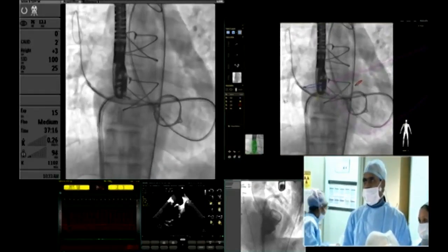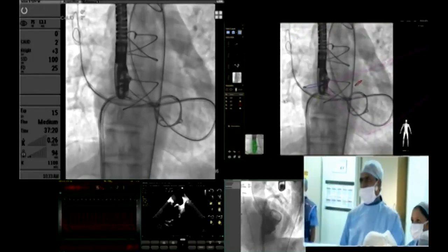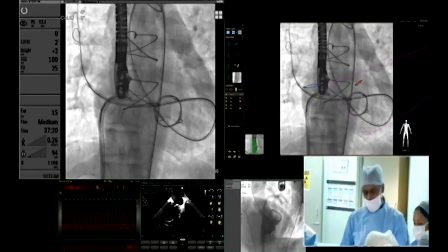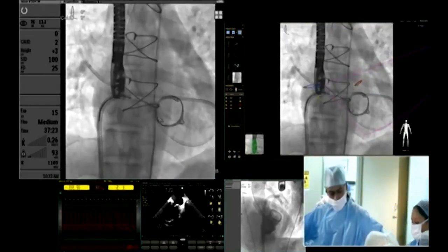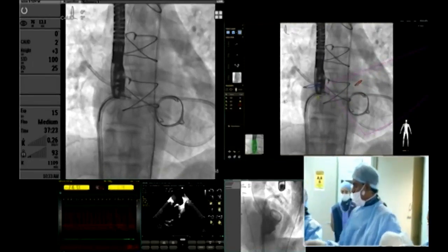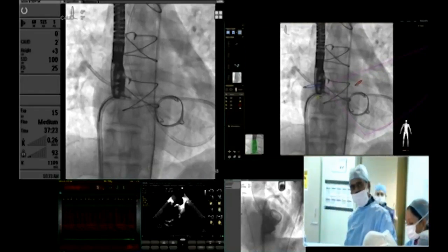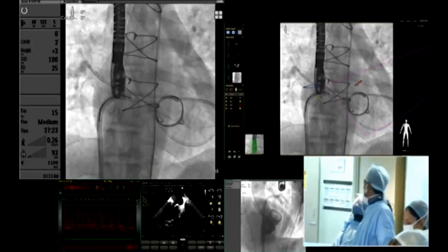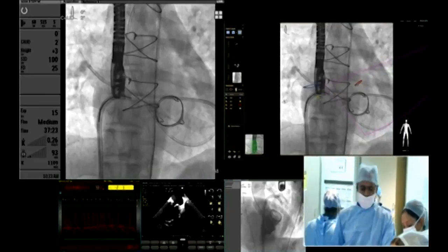I am stabilizing it here and pulling the guiding catheter. Dr. Tregan, I am actually planning to close it retrograde so that I can show the device opening out in the left atrium — that is very easily seen on TEE. I want the Amplatzer plug. I think a 10 plug should be okay here. It is 7 millimeters — give me a 12 plug, which will be okay. I am choosing a 12 AVP2.